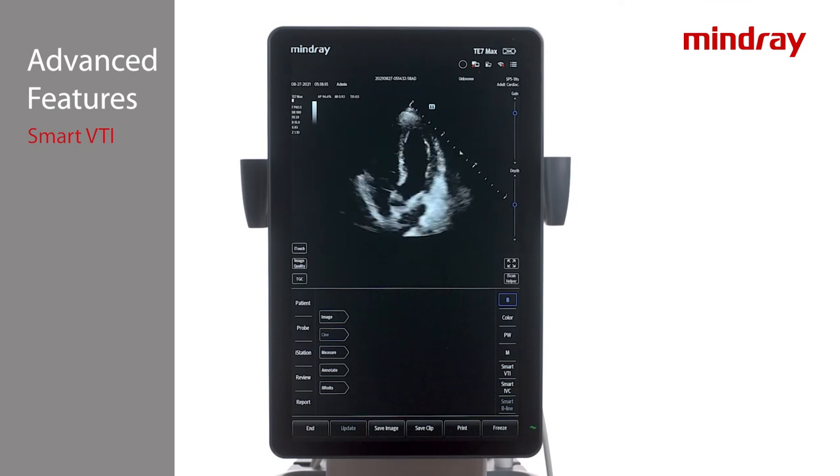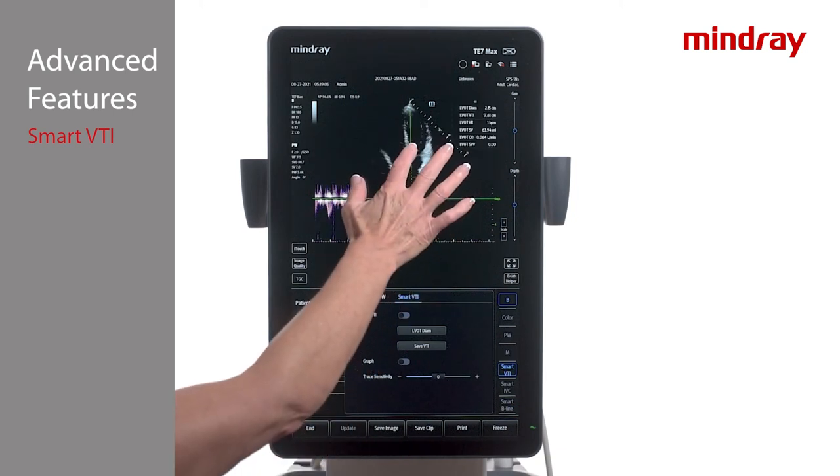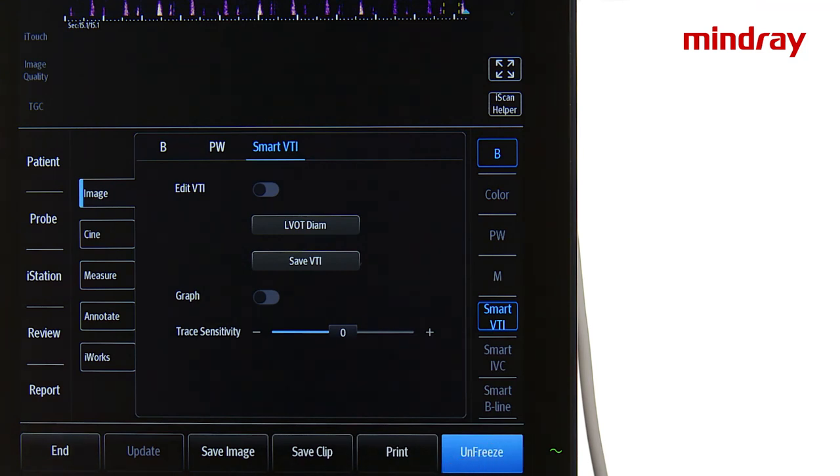Take care to tap the last caliper so the measurement turns white — this assures that the value is saved for the upcoming calculation. Next, obtain an apical 5 chamber view of the heart and activate Smart VTI with the tab on the lower right side of the TE7 screen. The system will enter pulse wave Doppler, automatically placing the sample gate in the LVOT. Adjust the position of the gate in the reference image if needed. The system will begin auto-tracing the Doppler envelopes and calculating VTI, SV, and CO data. Press freeze to stop the Doppler acquisition and the system will analyze the data.